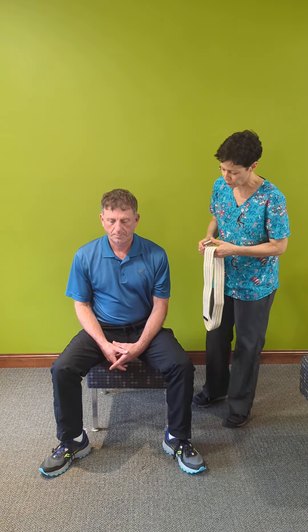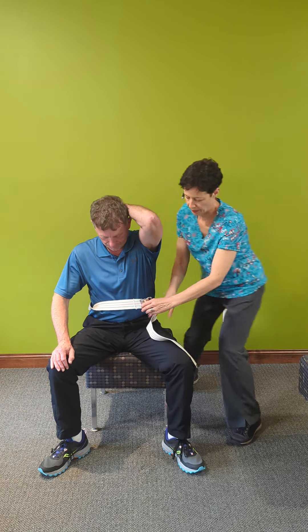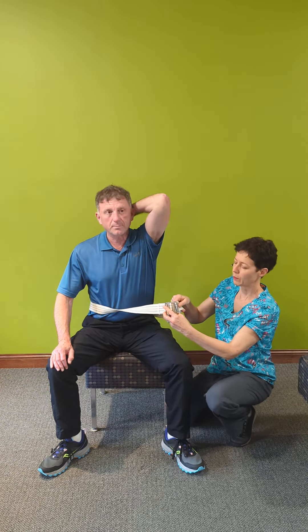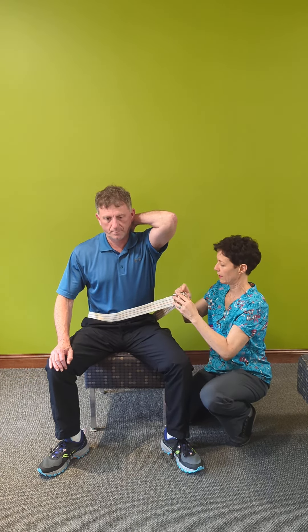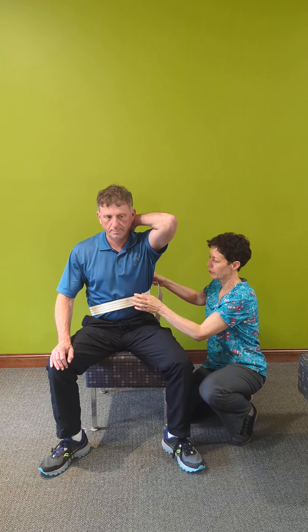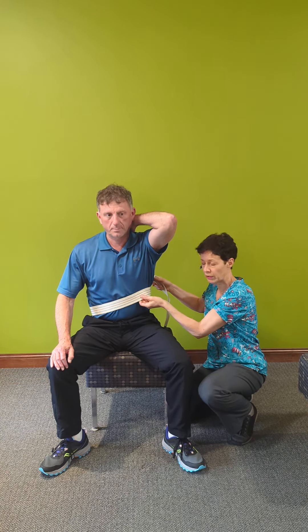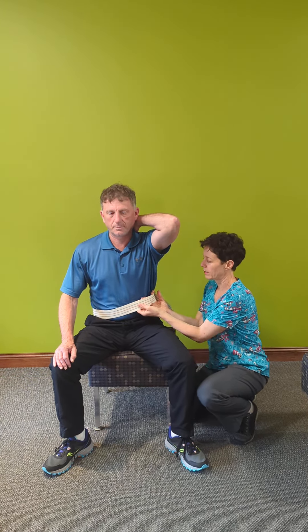I'm going to have Steve move his arm out of the way and I'm going to put the belt on. It has a very simple buckle mechanism. The way you tighten the belt, it needs to be just tight enough so that it doesn't slide up when you lift the patient, but not so tight that you cannot get your hands underneath it. This is going to be about right.